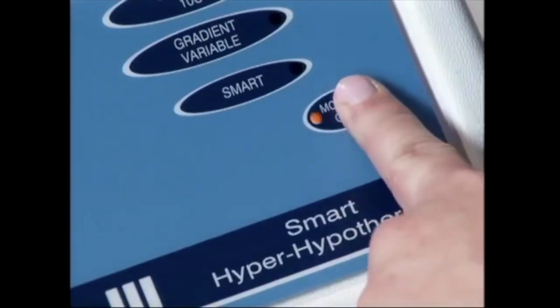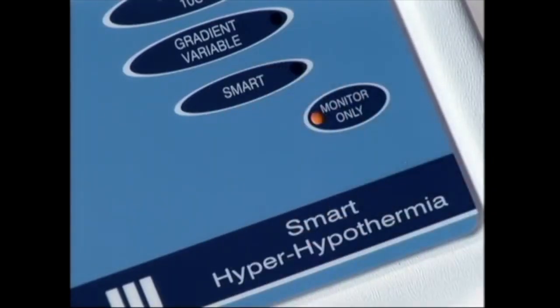The monitor only mode in the Blanketrol 3 can be used to just monitor your patient's temperature and evaluate if there is a need for the target temperature.